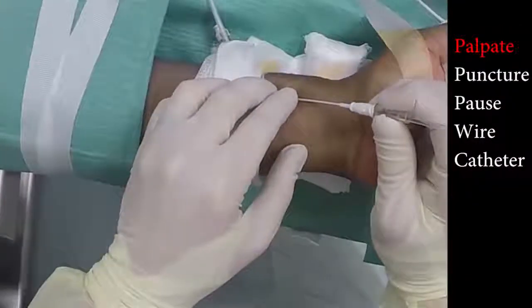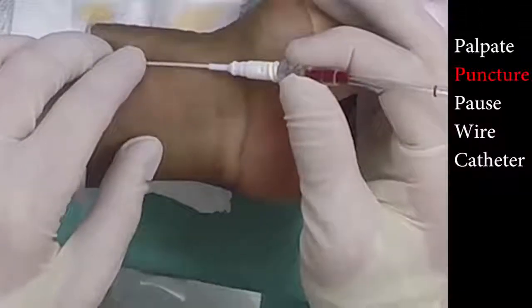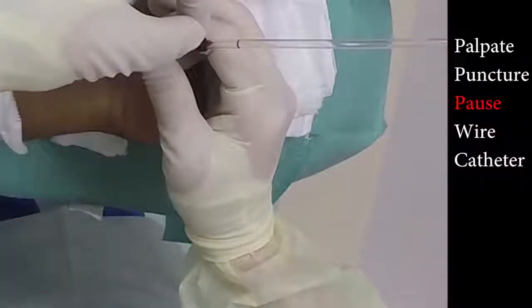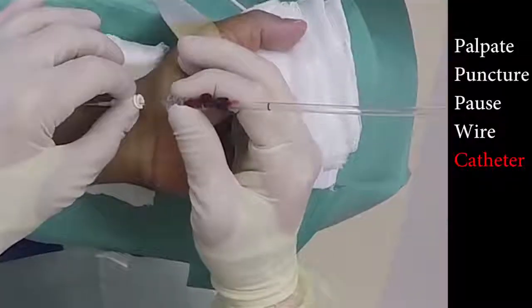Step 1. Palpation. 2. Puncture. 3. Pausing. Notice the hesitancy as the column stops rising, and readjustments. 4. Wire easily inserted. 5. Twisting off the catheter. Now for some quick tips.